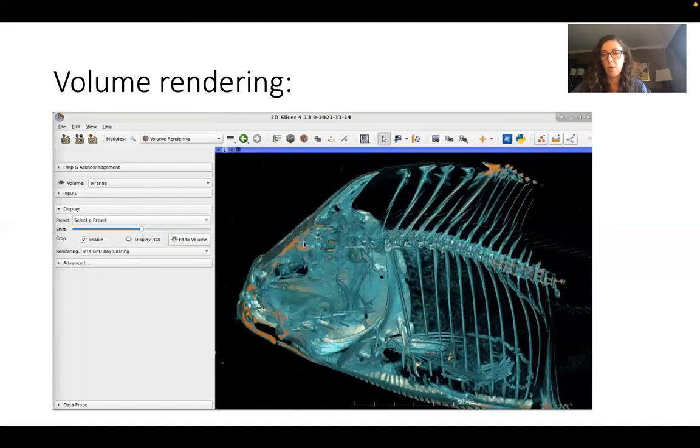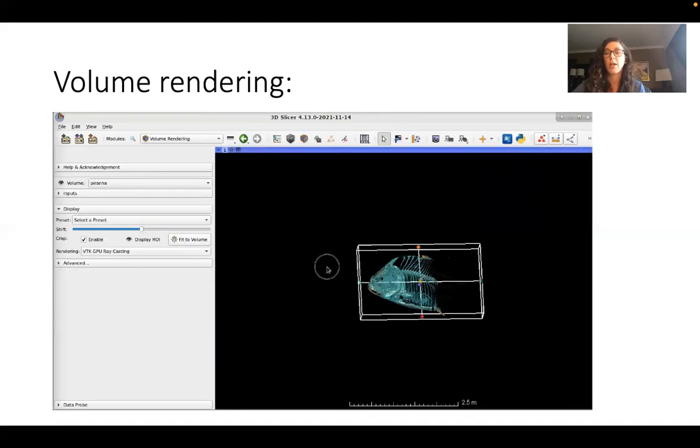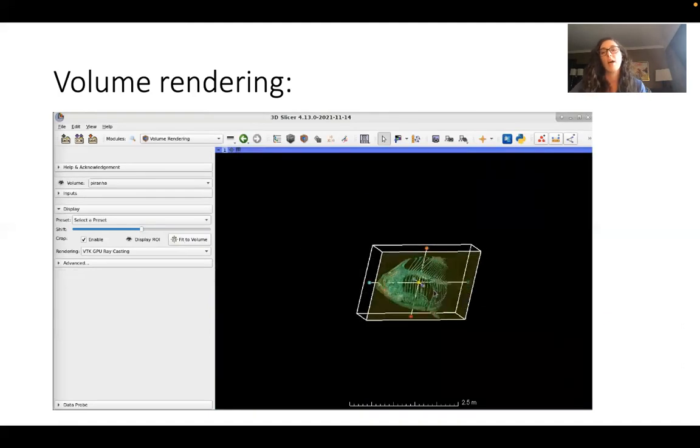And we talk a lot about what other objects can you see in the gut? Why can't you see the soft tissue in the gut? And we talk about how CT scanning works and that kind of thing. And so it just makes it a lot nicer.